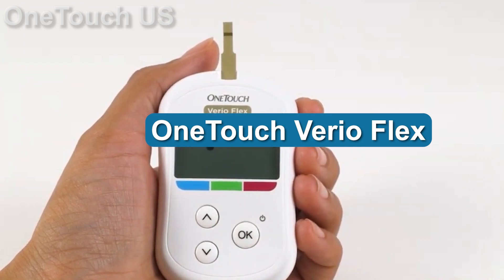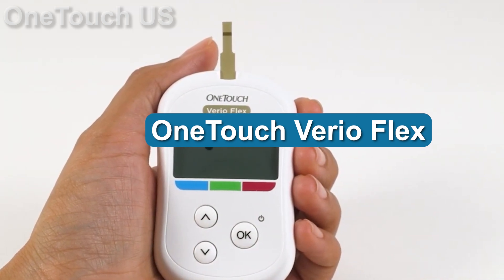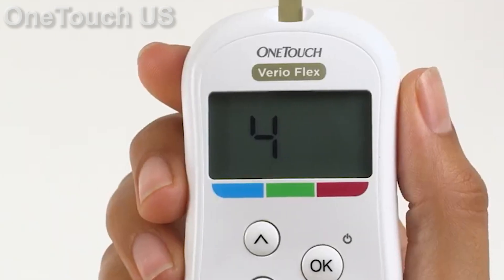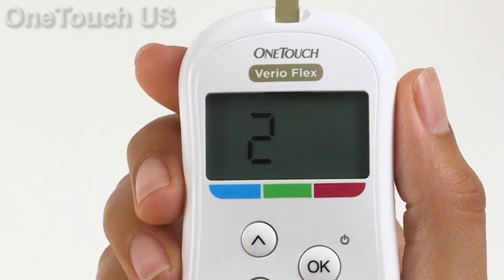The One Touch Vireo Flex is from a long line of blood tracking meters and has been refined over time to offer exactly what's needed. The new feature here is a color-coded result, meaning you can see how you're doing quickly and easily at a glance.